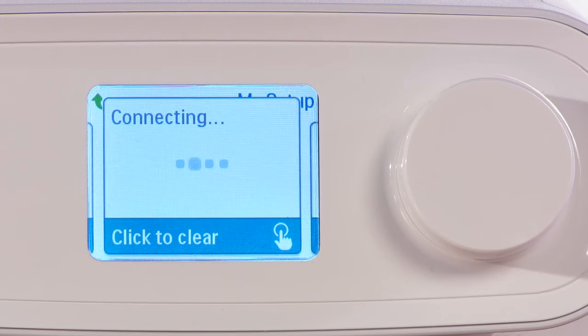A message screen will let you know when your Wi-Fi connection is complete.